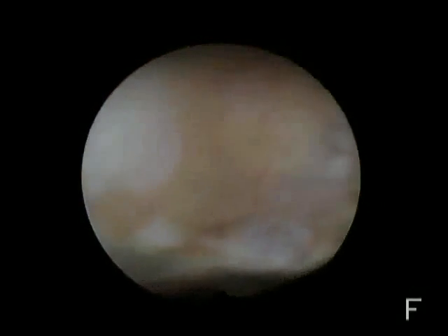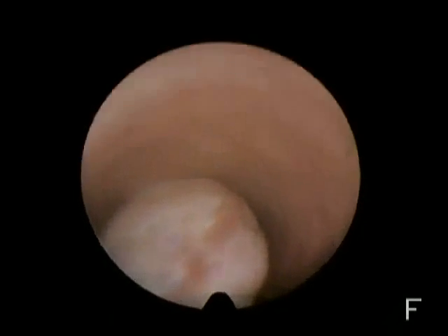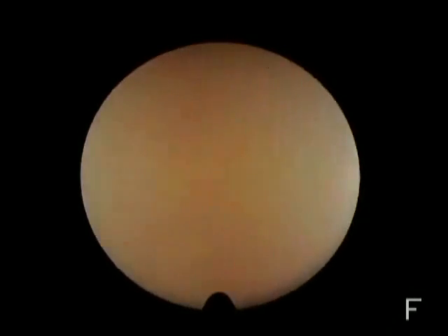And now we try to get on the top of the polyp. Try to see its pedicle. We go slowly, slowly. There it is. It's covered with flat endometrium, regular vessels. So it's all right, it's good. And we remove very slowly.